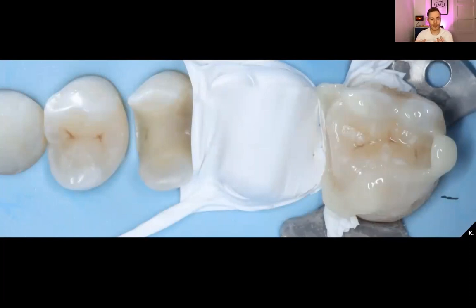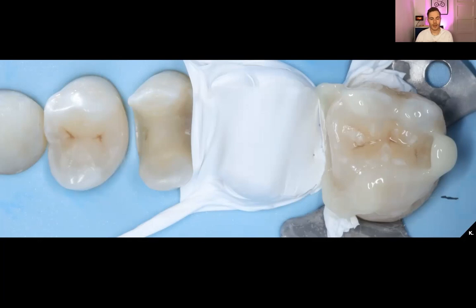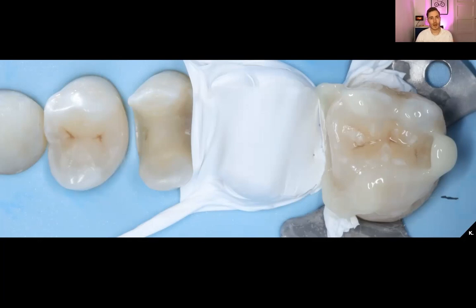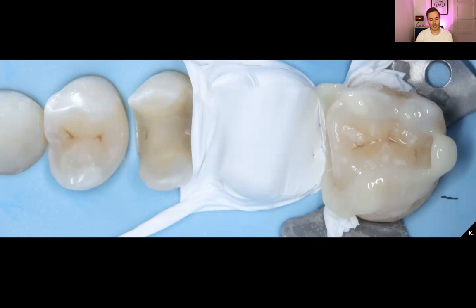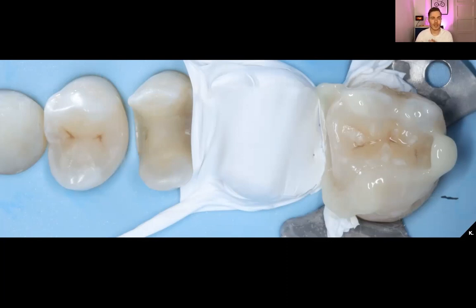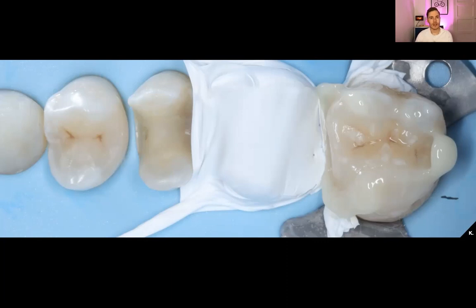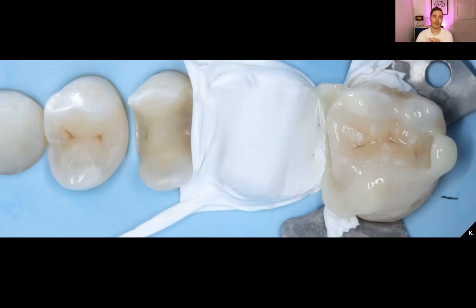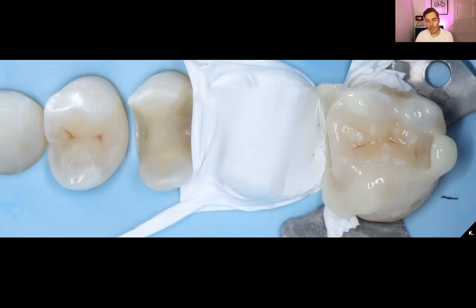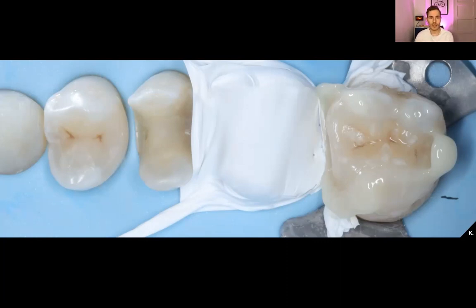I apply the Teflon in between the teeth, but I also apply a little bit of Teflon on the neighboring tooth that I'm not going to restore directly — to cover it and make sure that there isn't any bonding or composite on the tooth, since if it sticks on there, my indirect restoration might not fit anymore. That's the reason why I covered the first molar with some Teflon here.